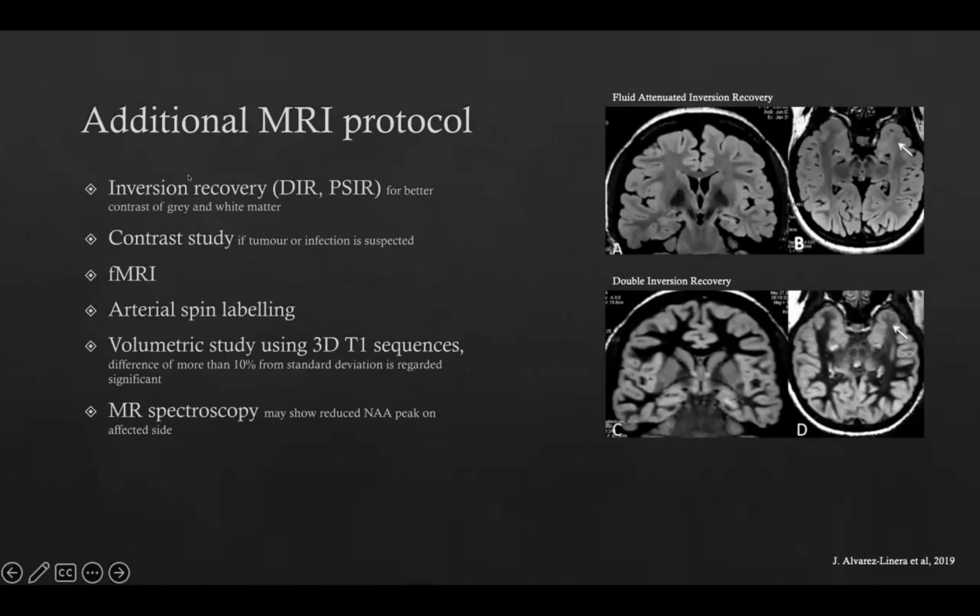Additionally, in all of the epilepsy protocol, you will also include inversion recovery. But in some centers, they can also have the better double inversion recovery or phase-sensitive inversion recovery, which will delineate the contrast between gray and white matter better.